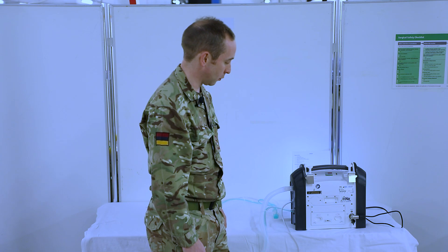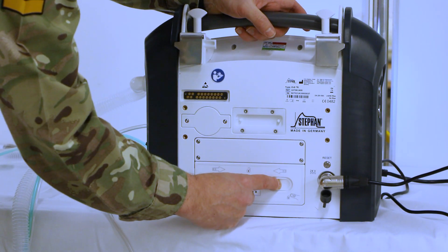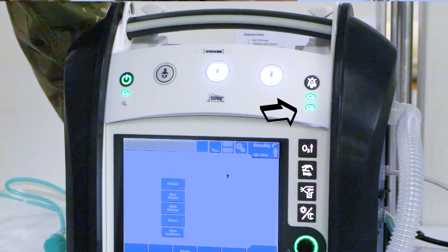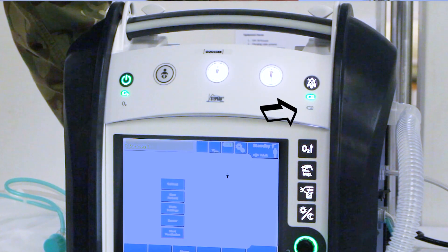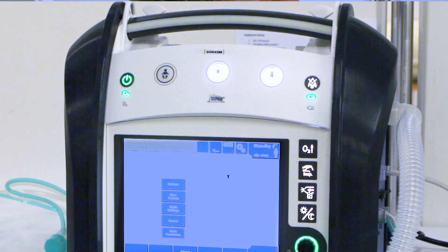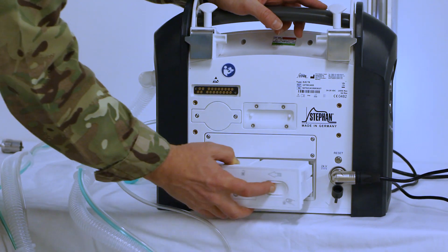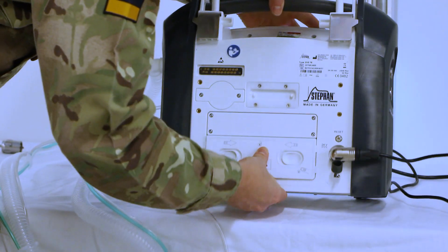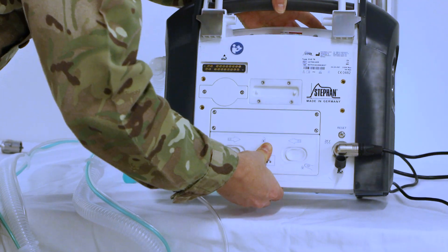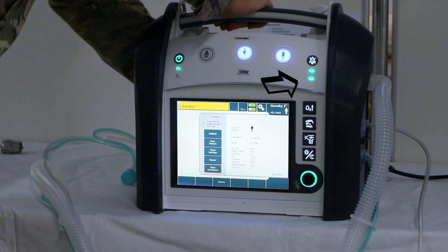Next we're going to check the external battery. We need to remove the battery by clipping the two buttons together and removing the battery, then checking on the front of the machine that the external battery icon has disappeared. Once we've checked that, we're going to reinsert the battery, ensuring that it clips in properly, and at this stage we'll be checking on the front of the machine to ensure that the battery icon has reappeared.